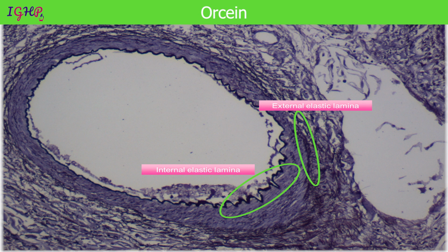Now for the elastin fibers, which I said are present in the arteries, you can do either an Orcein stain or a VVG stain, and the reticulin will also show positivity on the elastin fibers. And this is the internal elastic lamina which is showing a beautiful blackish color on the Orcein stain. So if you want to see the elastin fibers, like I said, they are always present in the arteries, and they make the arteries more pliable. If the blood is flowing through them, they distend, but if the blood is out of the arteries, they collapse.